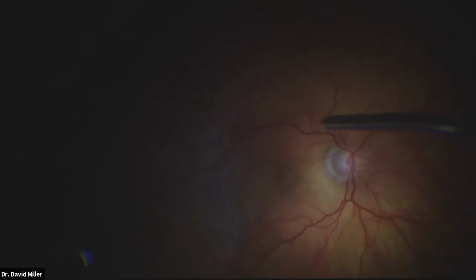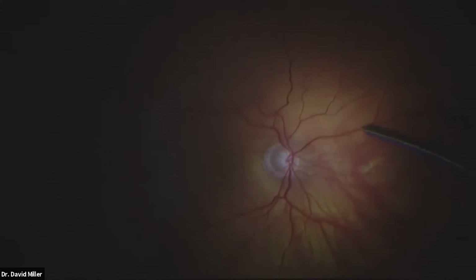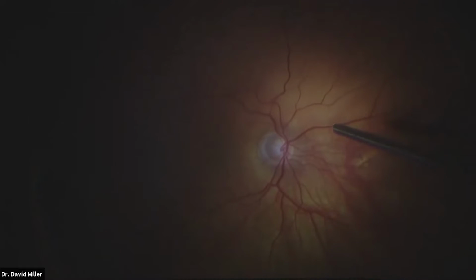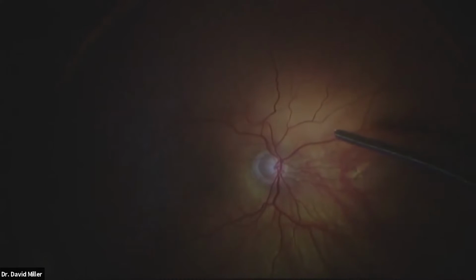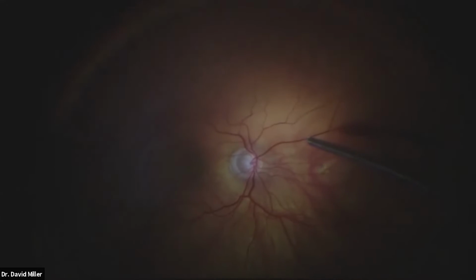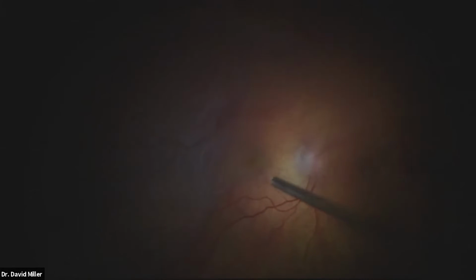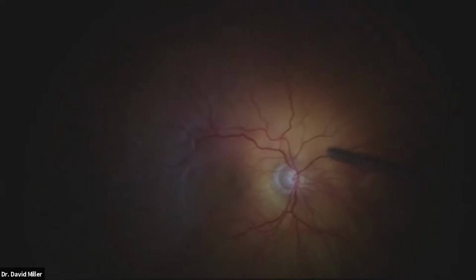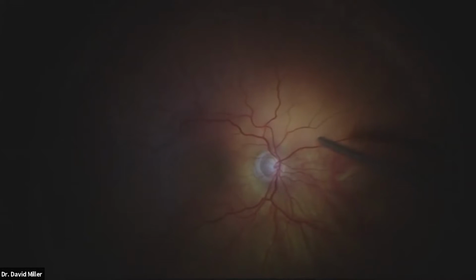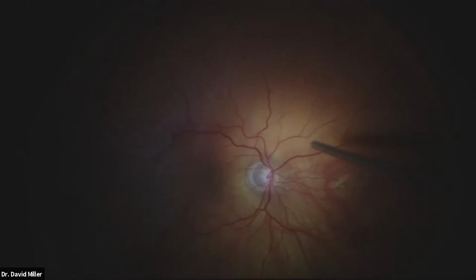Very good. Now, as far as draining the retinal detachment, I might as well make that retinotomy while I'm here. I'm going to use a posterior drainage retinotomy. Can you focus the posterior? There you go. So you can see the detachment goes this way. I'm not going to drain in the macula. I don't like to drain too far temporally because it's harder to drain. I like to make my retinotomies more posterior, within a few millimeters of the optic nerve. Nasal is always a nice side to drain on.